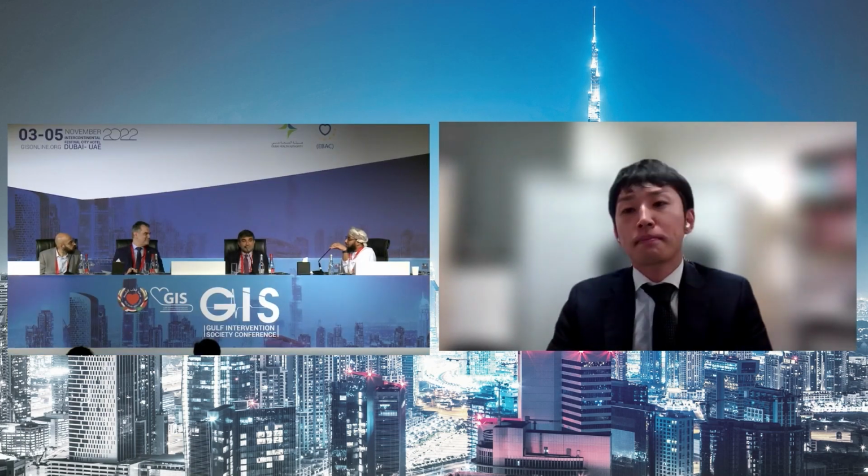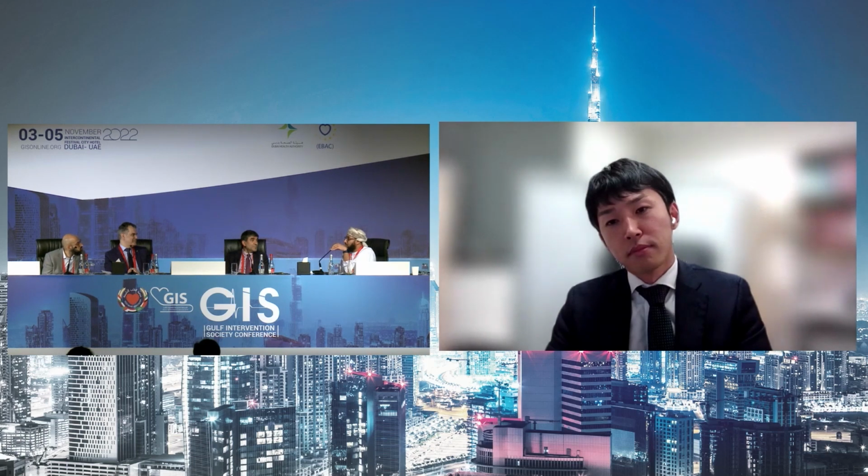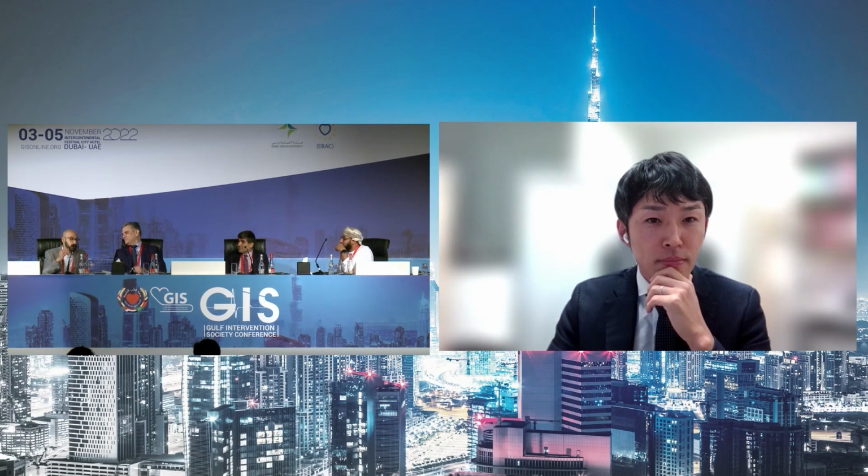Sometimes it is useful, but sometimes it's actually taking more time, as Dr. Muhannad said. One thing I noticed is that after every step, they repeat the imaging, maybe for educational purposes. I think that's very important. It's very important to show, as Dr. Ueki showed, the response to the debulking or fracturing techniques that you are doing, so you will understand if you end up having a really expanded stent or not, or if you need additional steps to be done. So it's very important to do it in a stepwise manner. Very good.